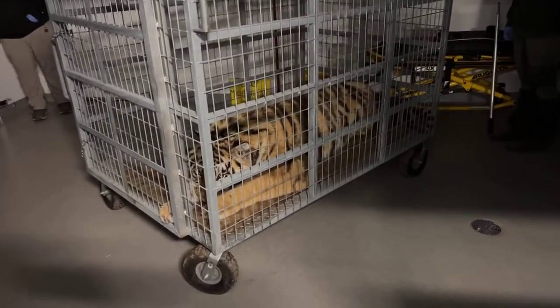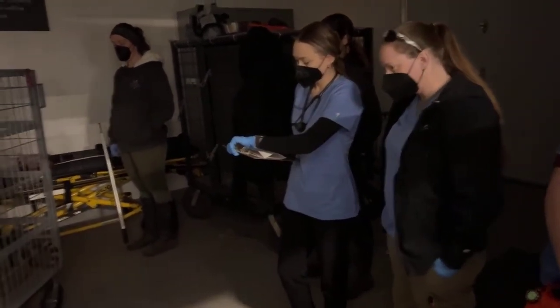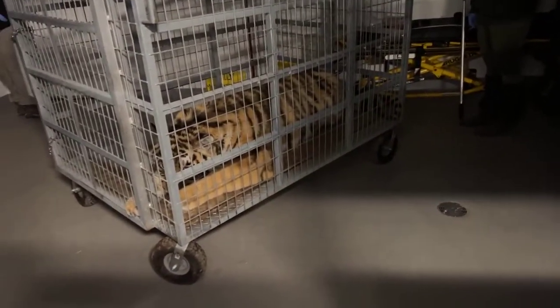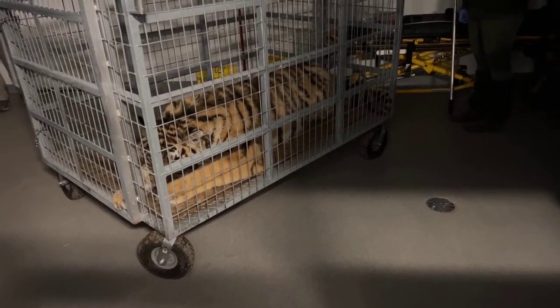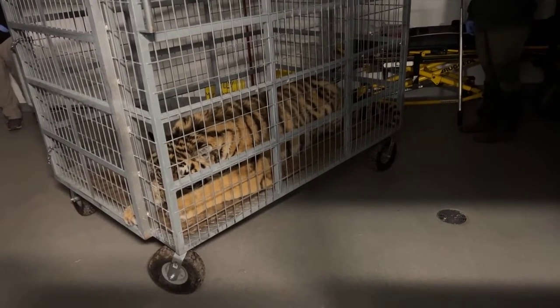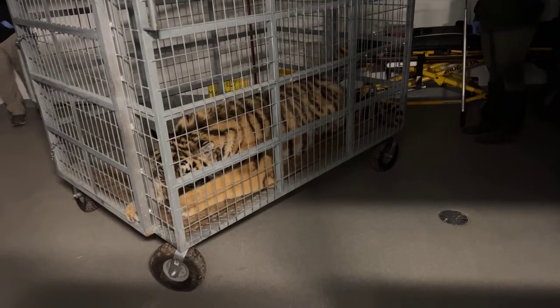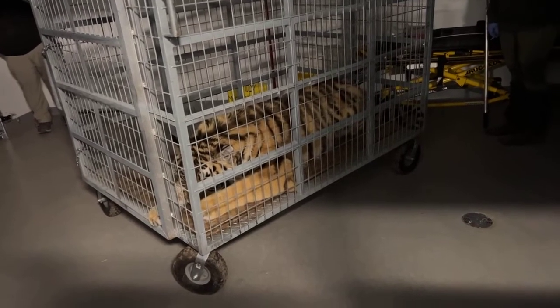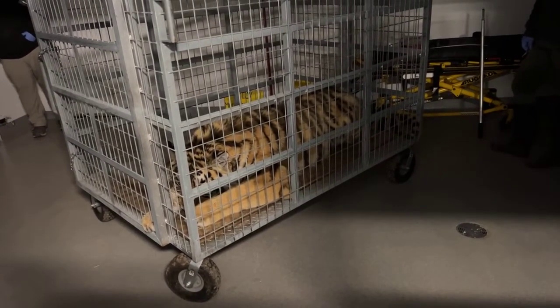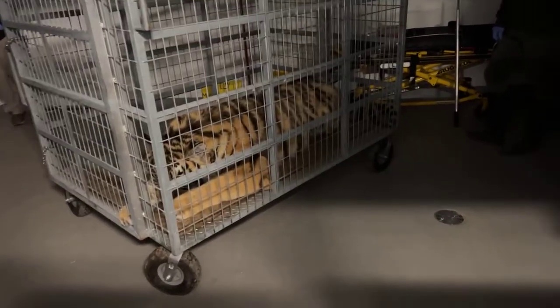So when a cat's going down, we also have our vet team here. They're watching the position that he goes down in to make sure that he is breathing well, that he doesn't twist his neck or anything. We also watch to make sure that he's in a good position if he were to vomit while going down, because we don't want them to aspirate. We're talking quiet, and we usually turn off the lights to try and decrease any stimulation so that he's not fighting anesthesia. He's in a great position for going to sleep right now.